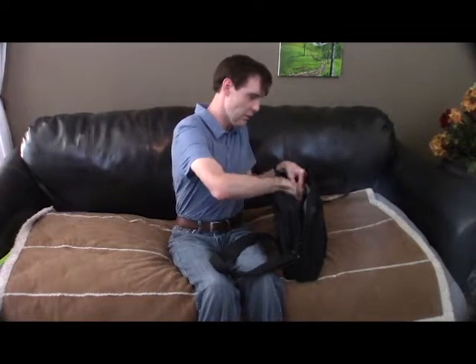In this pocket here, you will find a Samsung Galaxy Note Pro 12.2 inch. This is the main attraction of what is called a CCTV, closed circuit television. This allows somebody with a visual impairment like myself to read print at a larger font. But this isn't the only thing that helps make this Samsung tablet a reading device. There is software provided by a company called Humanware that makes that possible.